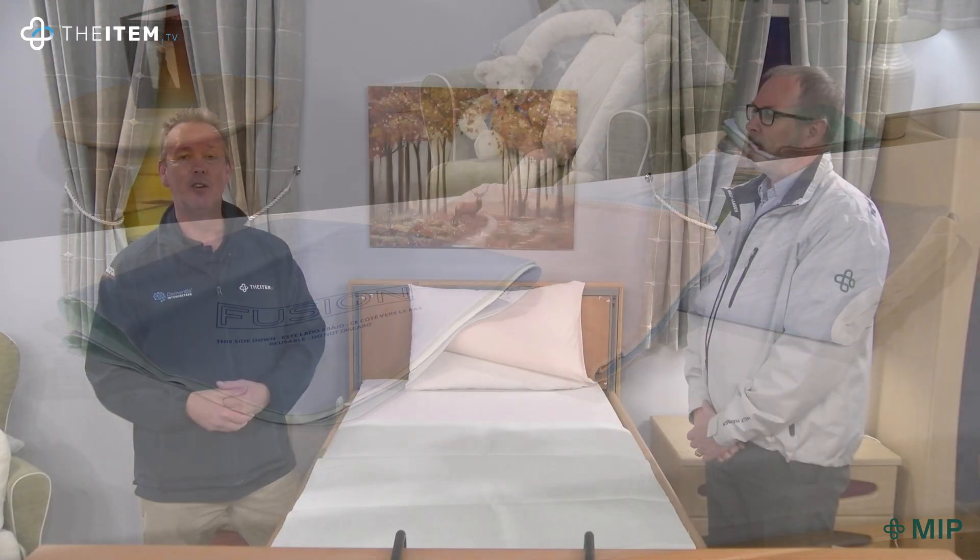That's item number Q103, the Fusion Bed Pad from MIP. Incontinence can become a problem for a lot of us as we get older, and if we don't address this properly it could result in other complications and conditions. So it's vitally important that we get the right bed pad and get it in place. This is item number Q103, the Fusion — the top of the range bed pad from MIP.